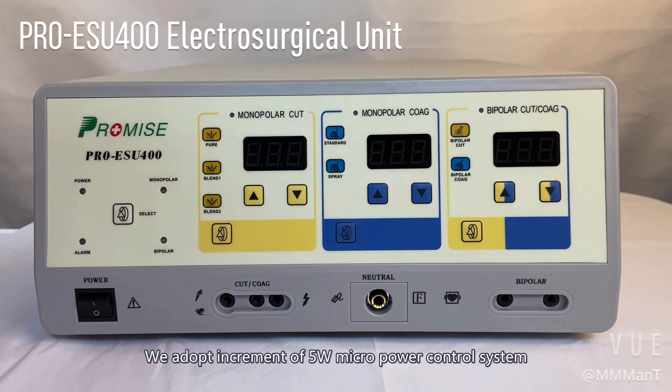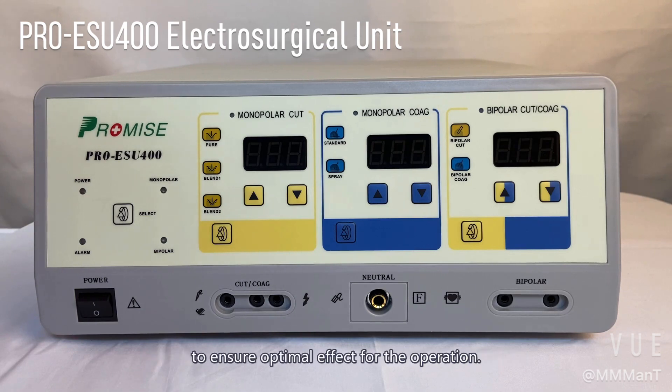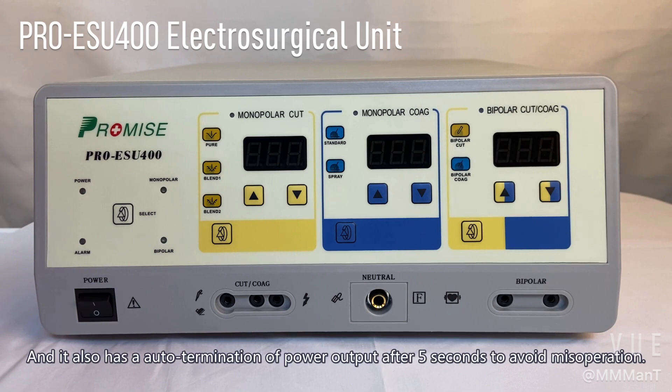We adopt increment of 5W micro power control system to ensure optimal effect for the operation. It also has auto termination of power output after five seconds to avoid misoperation.